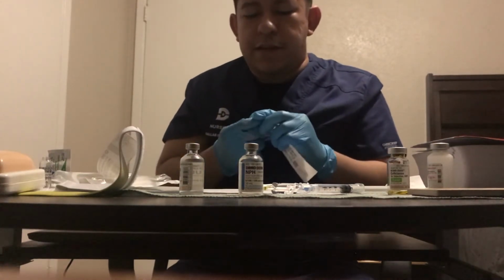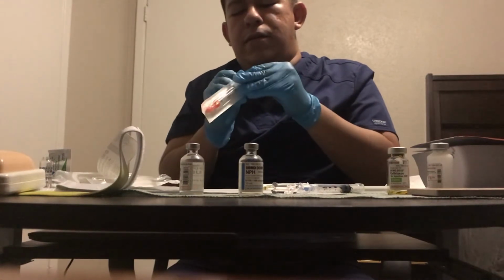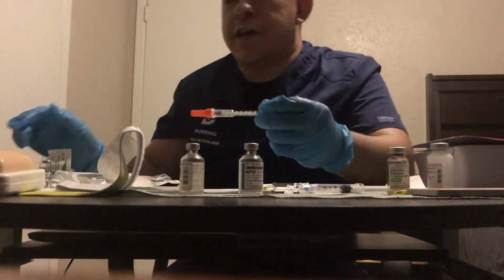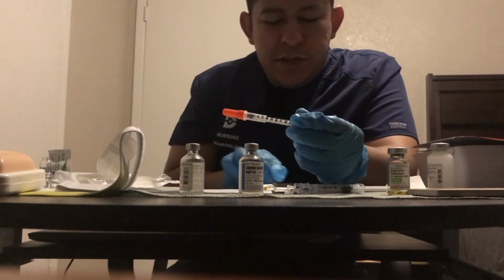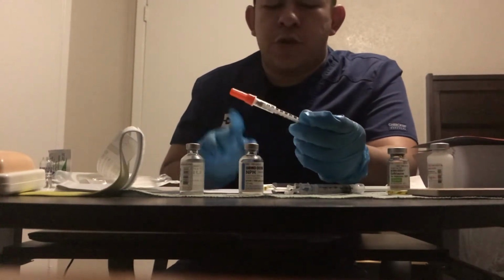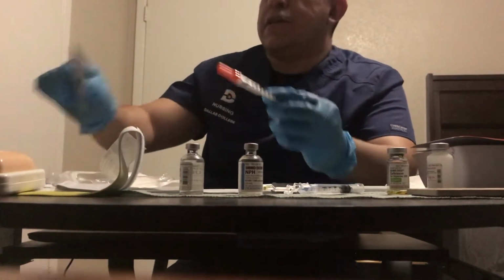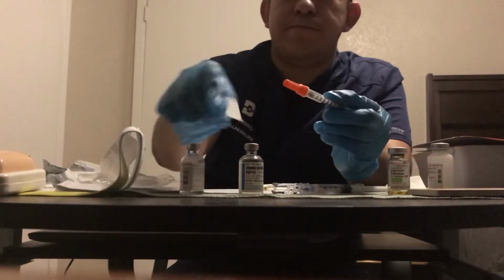And it looks like since his lab values say that his sugar was 389, then according to the sliding scale, we must draw up 12 units of sliding scale regular insulin. So it'll be 12 of NPH, 12 of regular. And of course, you take the tops off of your vials. Make sure you wipe them.